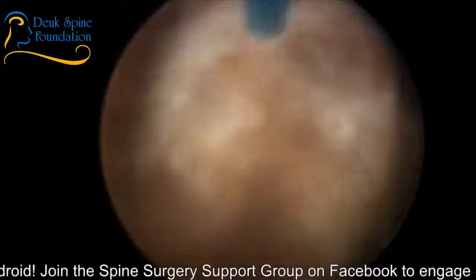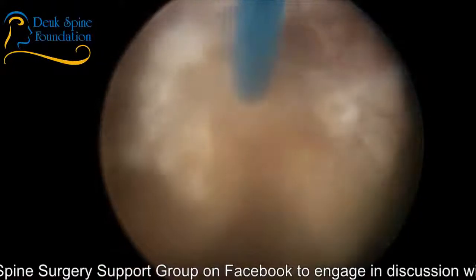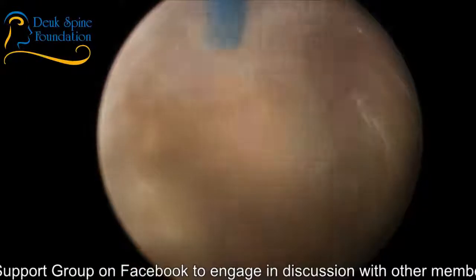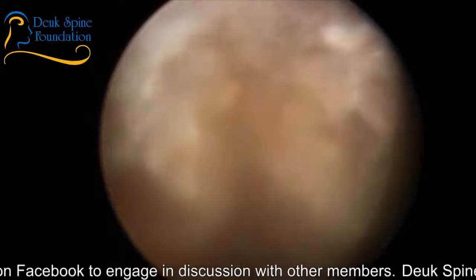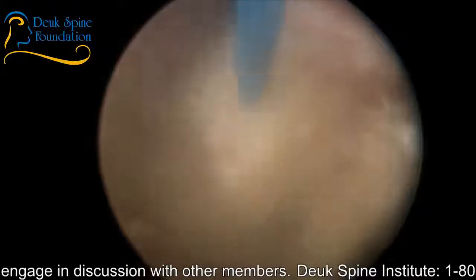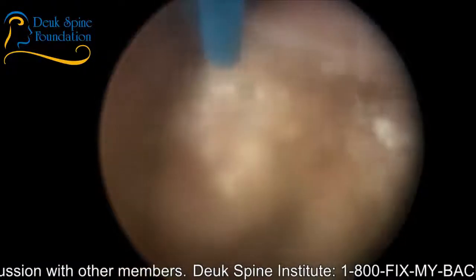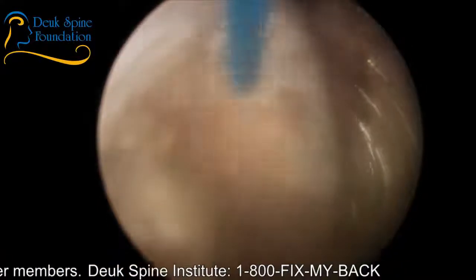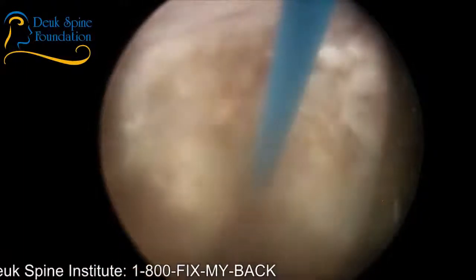That's not our goal. Our goal is to make this patient pain-free and restore her leg function on the left side. That's our goal. To do that, I need to unpinch the nerve, and I need to repair the annular tear, basically. Get rid of the tear and the inflammation in the tear. All right. I should be able to show you her nerve in just a minute when I'm done.